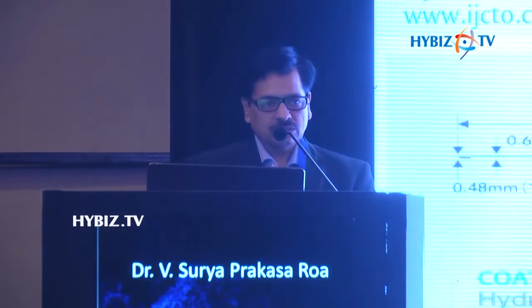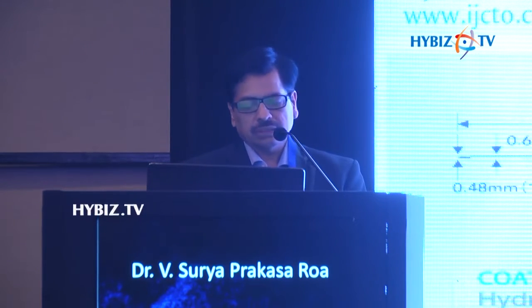But this is one sheathless guide, because the outer diameter is equal to a very small sheath introducer. This can be used in cases where CTOs are accessible with simple, not very complicated things, not many multiple devices used. You can use this sheathless guide for CTO PCI through radial, because we can minimize the vascular complications. That's the main advantage.